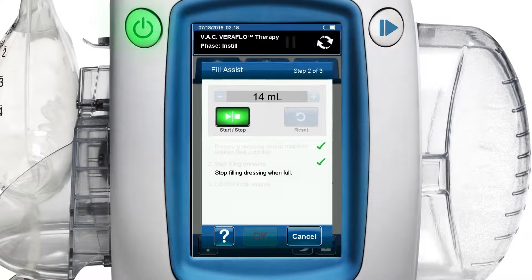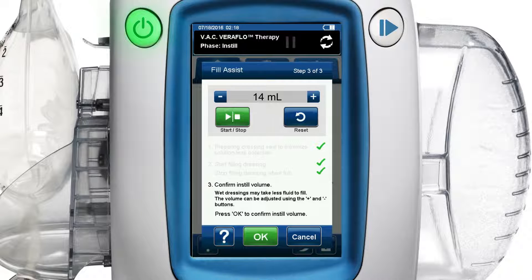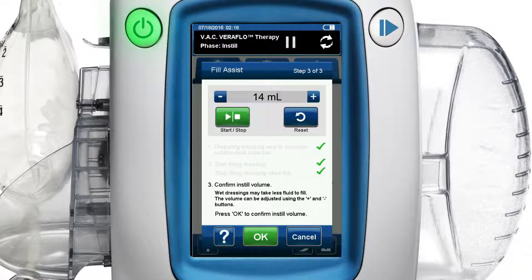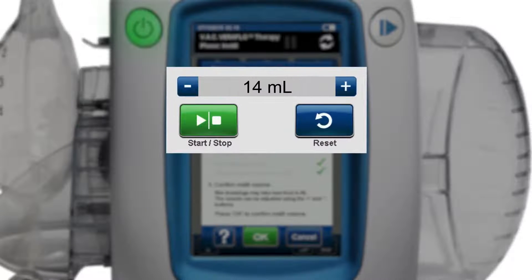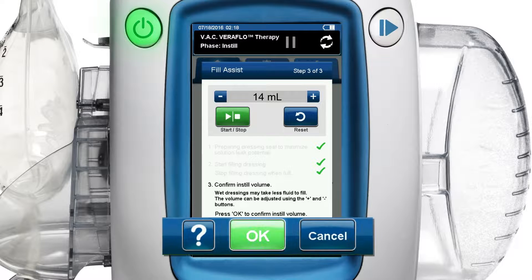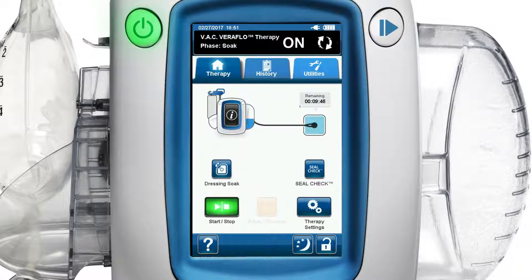Now step three of three of the fill assist screen appears, awaiting confirmation of the volume setting. Because wet dressings may take less fluid to fill than dry dressings, consider reducing the volume 10 to 20 percent by using the plus and minus buttons before pressing the OK button to confirm your fill volume and move to the next screen.